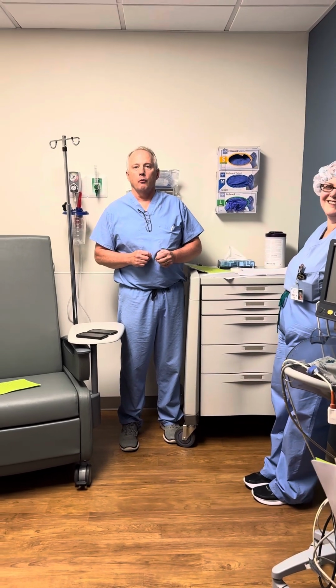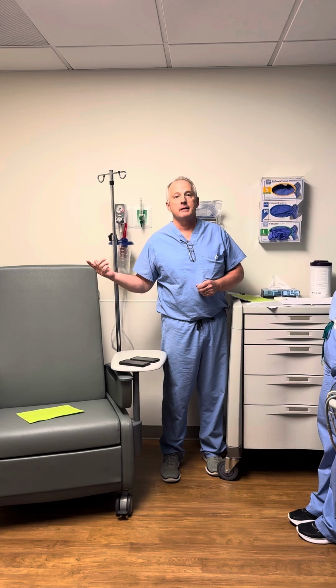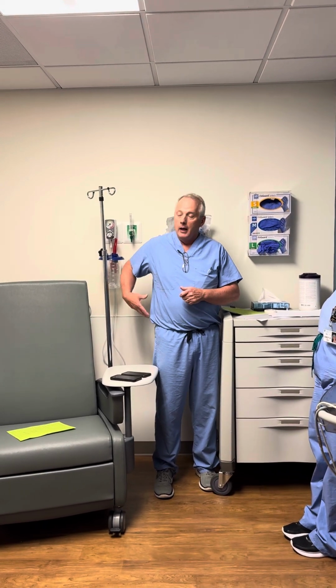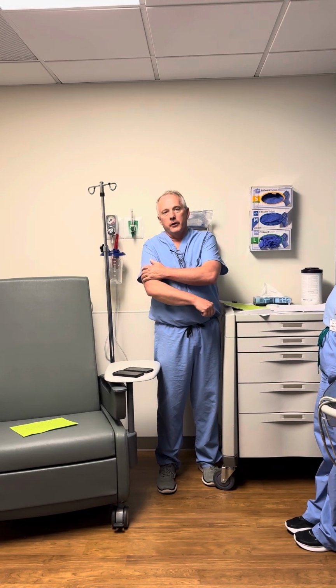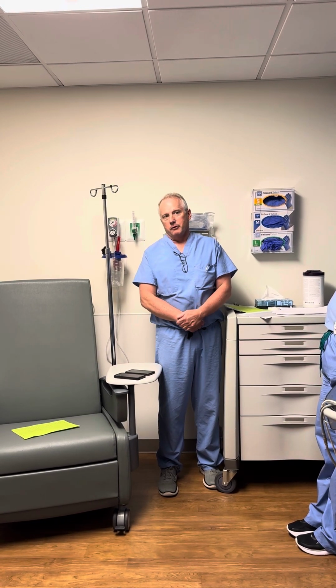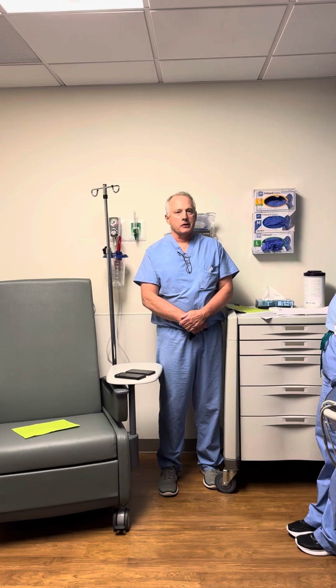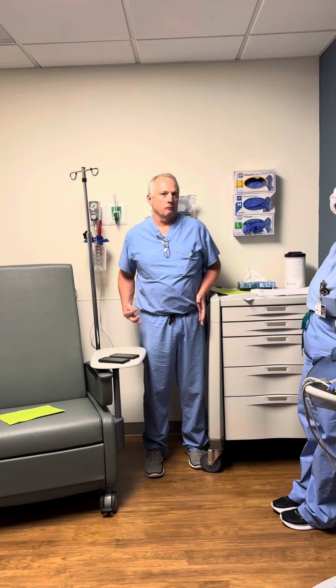Right, because with those, if you don't know if that current's going through there, if it's going to elicit a response that you may not see for 5 years or 2 years, could it end up in avascular or some sort of necrotic situation down the road? So I would say try to go to the flank, or the arm, and just have them as still as possible. You're going to run into situations like that. They're pretty rare, it's rare to have somebody that's really completely bionic.